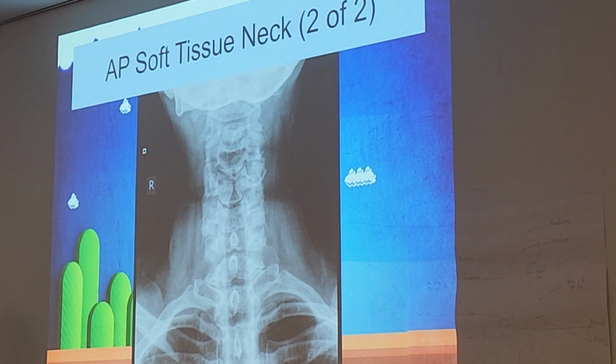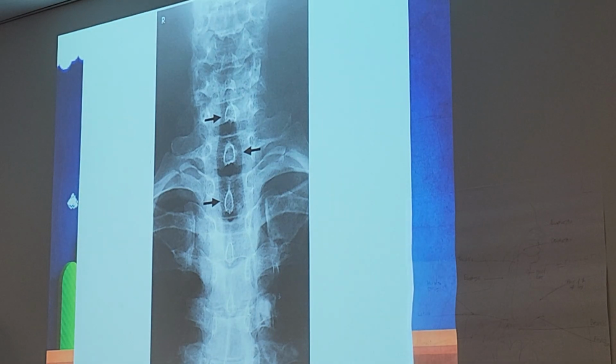And of course, that's the way it should look right there. We see that same pathology as before. That's that same picture, by the way. And I can see what you mean by that looking angled. I don't think that's angled. I think this patient has a long neck. Because I don't see distortion on the other areas of the mandible or the ribs. Daddy long neck. And that's one that's been centered a little bit too low.